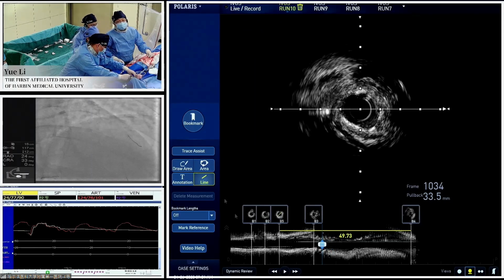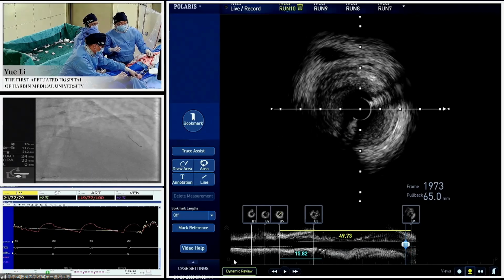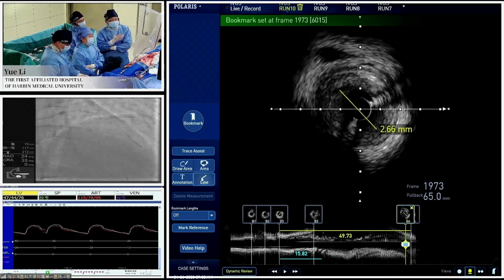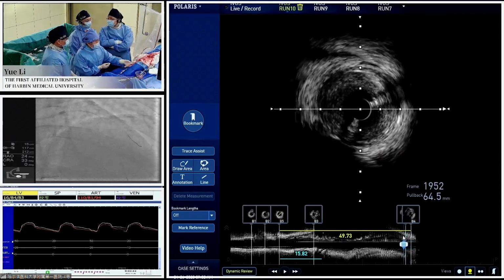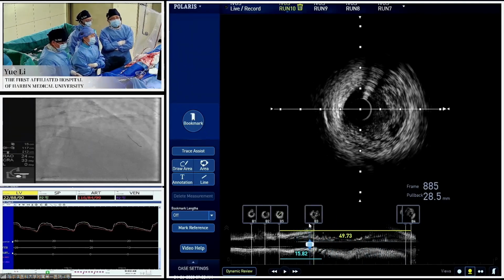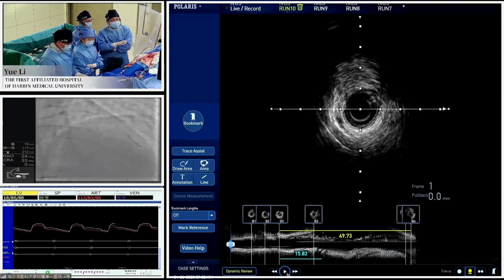So Professor Lee, do you want to put IVUS into the diagonal to make a double check or not? Maybe after the balloon. Yeah, I will recheck again manually. And because of the time limitation, the live demonstration may move on to the next PCI. I think we have already successfully recanalized the CTO lesion. And Doctor Chao already gave us a wonderful closing remark to show the audience all the learning points. But the optimal stent implantation still needs imaging. Yes, so IVUS guidance is very important.